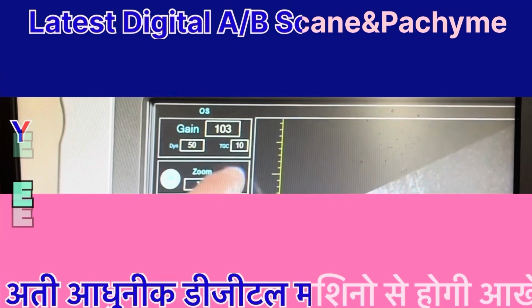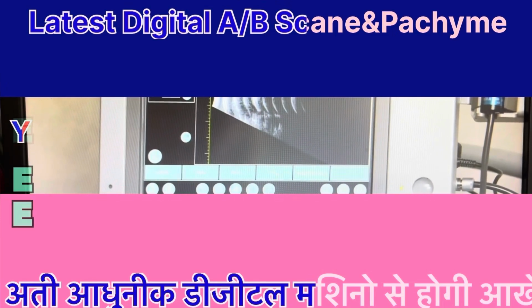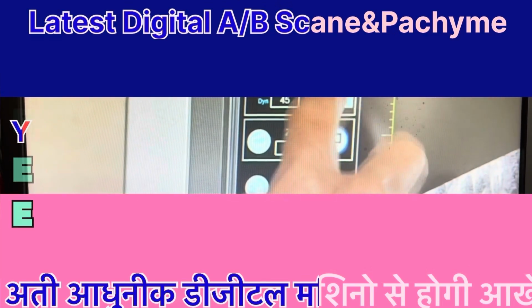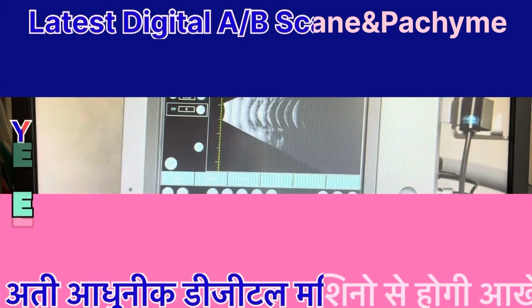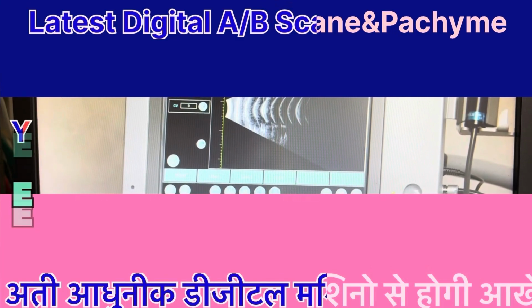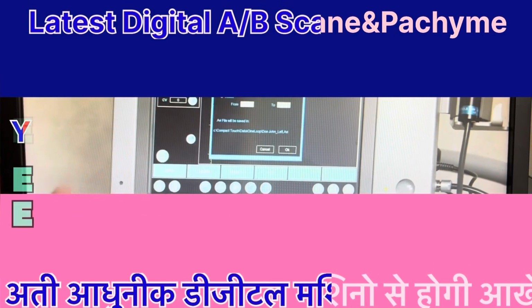To the left of the image area is the parameter field, where gain, dynamic, TGC, and zoom are shown and can be modified by touching each field and using the gray knob or the virtual keyboard. Selecting the full screen icon on the right side of the zoom field allows the examiner to view an image in full screen mode. Parameters such as gain and TGC can be adjusted by turning the front knob or by clicking in the gain field and using the scroll wheel.